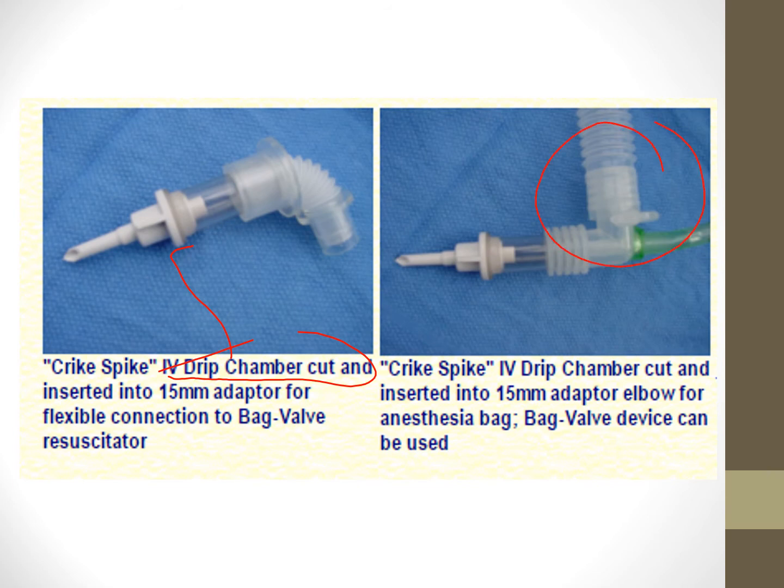Now you just got to understand the lumen, because of Poiseuille's law, smaller lumen or smaller radius, I should say, if we're talking about Poiseuille's law, that radius is going to mean you have high peak airway pressures. You're going to have a harder time getting gas to go in and a harder time to get gas to go out. But at least you're getting some gas going in and some gas going out. It's some way to ventilate and oxygenate the patient. I hope that makes sense.